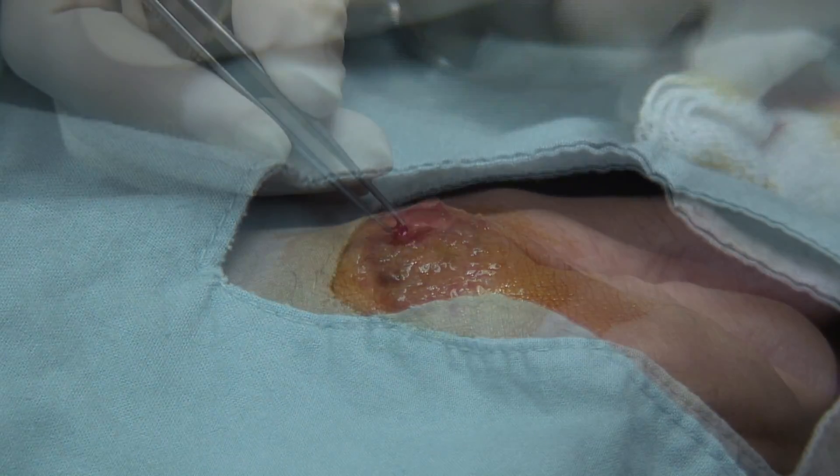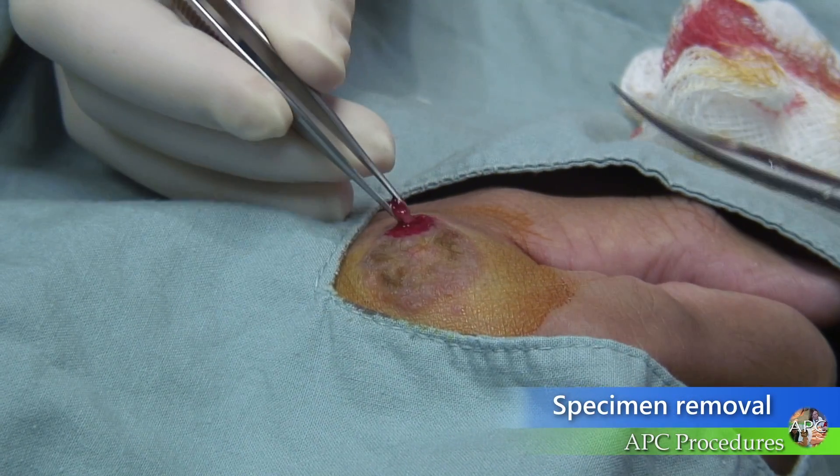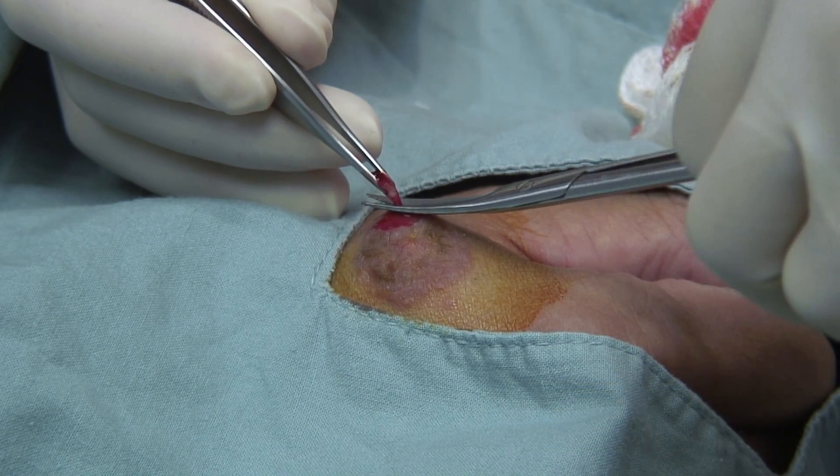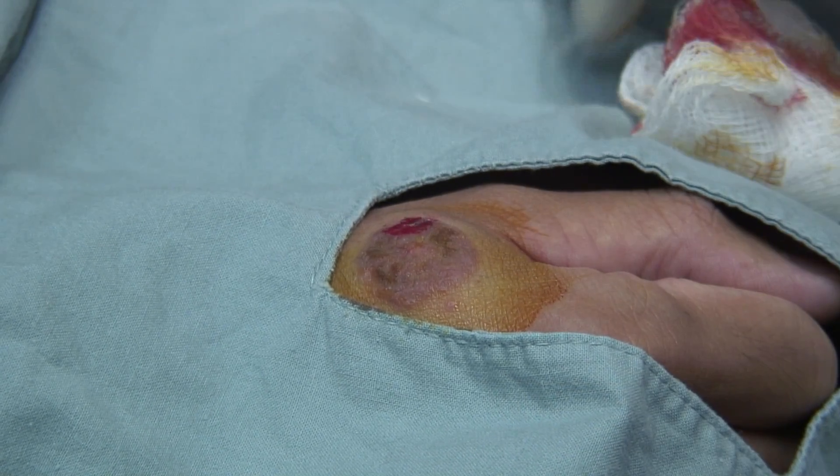Withdraw the punch. Gently grasp the specimen with forceps or a skin hook. Lift the specimen and free it by cutting the subcutaneous base with sharp tissue scissors.